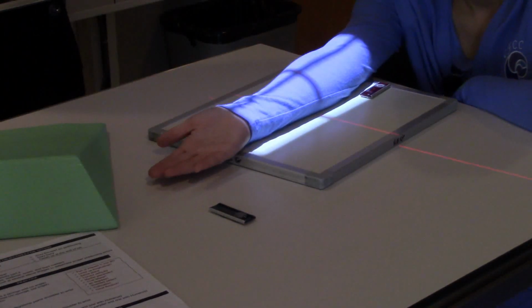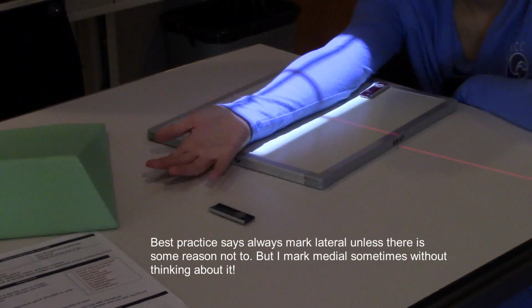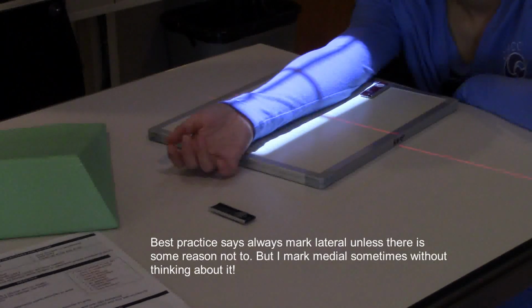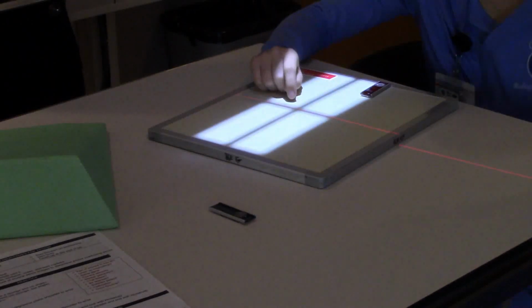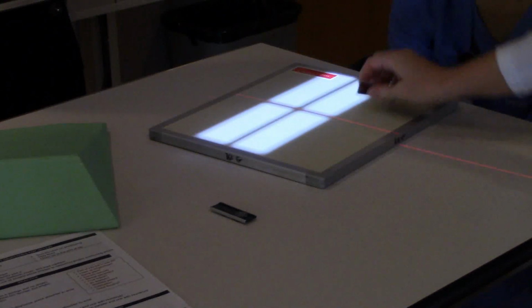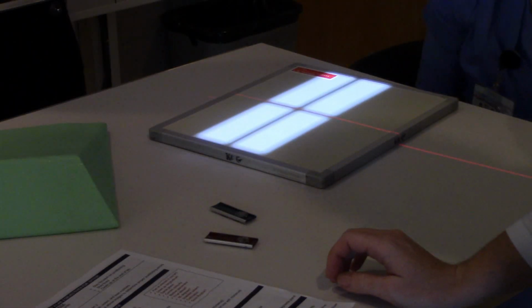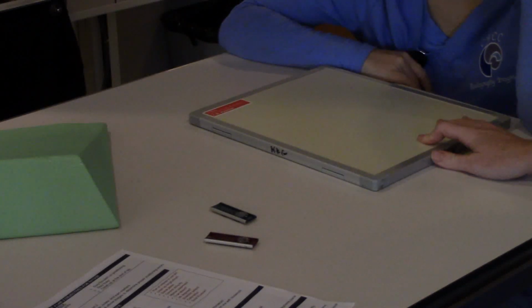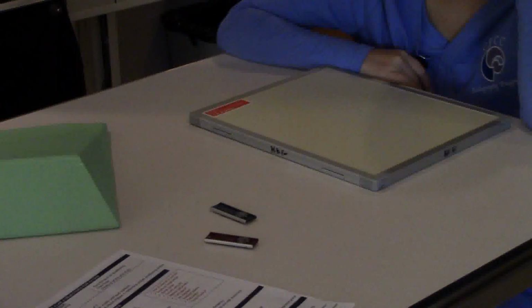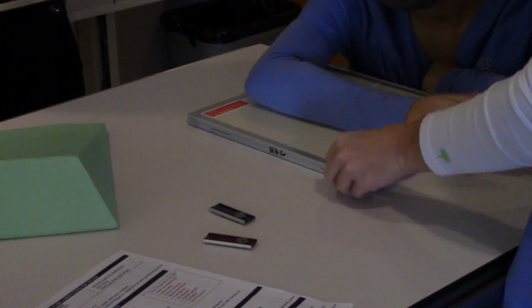Okay, that looks pretty good. We're just determined to mark this thing medially. So I guess that's what we're going to go with. I know, I keep going. I do too. You're not alone. Okay, that looked pretty good. Now we're going to do the next image, which is the lateral forearm. Now for lateral forearm, as long as her arm is straight out like that, can we just turn it up like this and call it a day? Well, we might, but that's not a very good idea. We're going to bend her elbow.